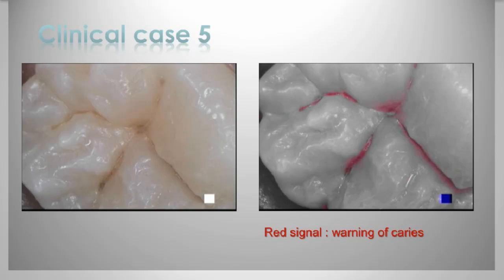So there was no talking her into it, so I proceeded, and I thought, you know what, at least I have my camera, and I could put it on the caries mode. And lo and behold, very much like what we have presented here, that's why it reminded me of it, out of each quadrant, 2 molars and 1 premolar in all 4 quadrants either needed a sealant or an occlusal composite.